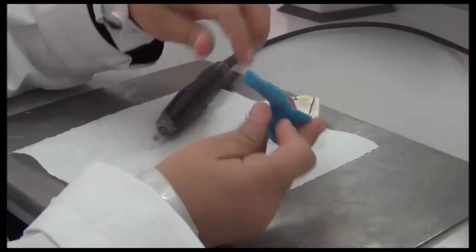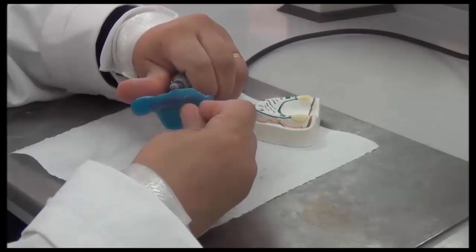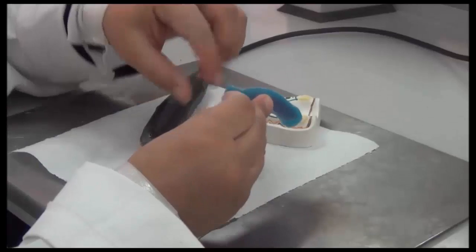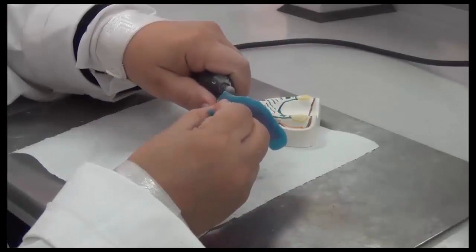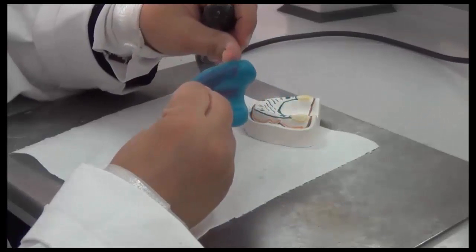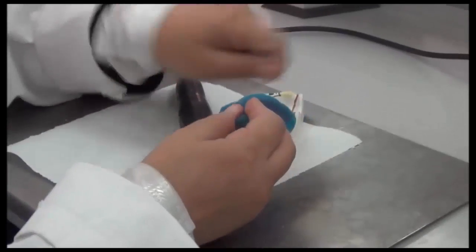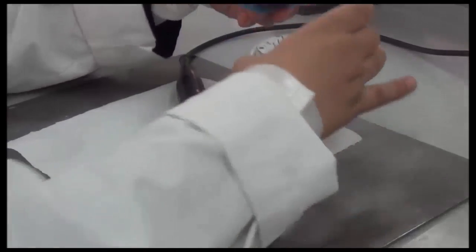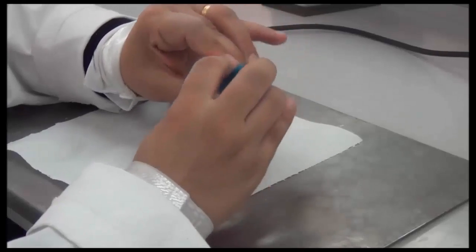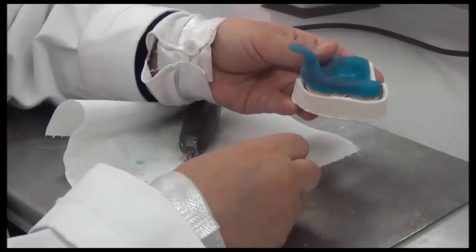Once I'm finished, if I run all around, I should have no sharp edges. There's a sharp edge here that I detected by my finger. So I should have no sharp edges. There's a raised bit here. It's a bit rough, but not sharp. This is where you need your old toothbrush, where you can brush away the particles. And then I adapt it back to my cast and make sure that all of the borders are following the orange line here.